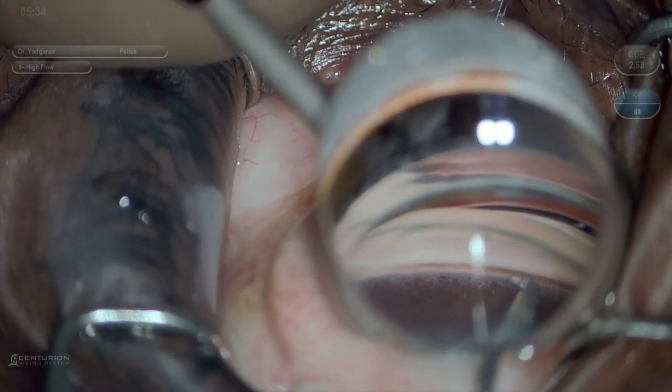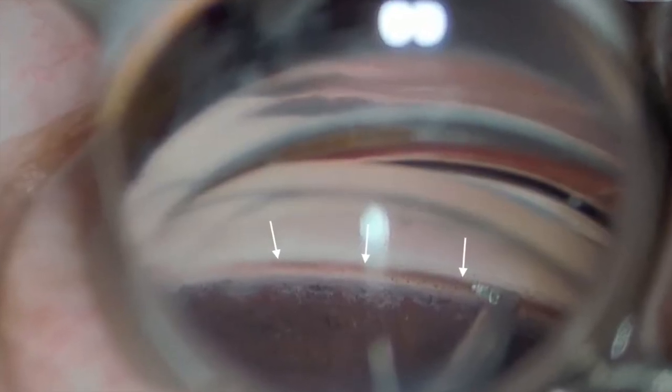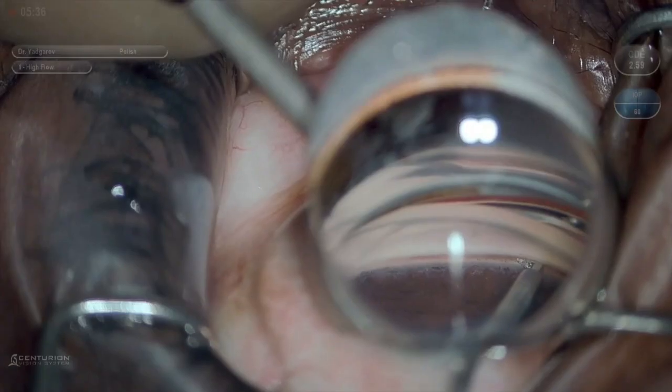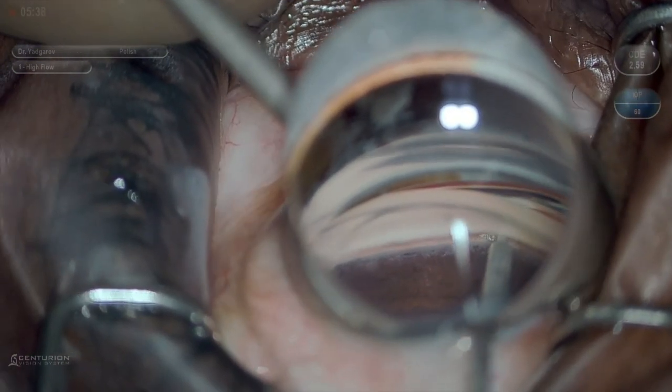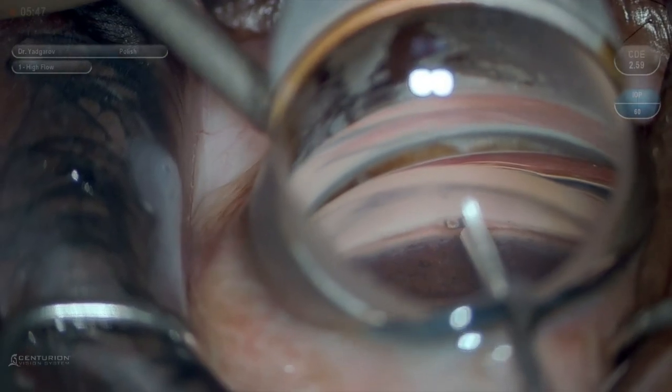Here is a surgical video depicting the procedure. The trabecular meshwork is well visualized here. The Scion tip enters Schlem's canal with ease, despite being blunt tipped. Once I am in the canal, I am able to move the tip of the device along the curvature of Schlem's canal to perform the goniotomy.